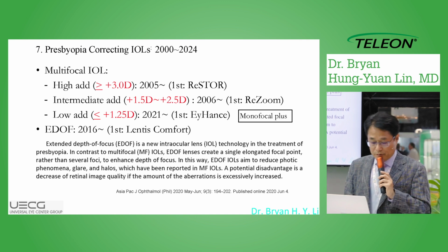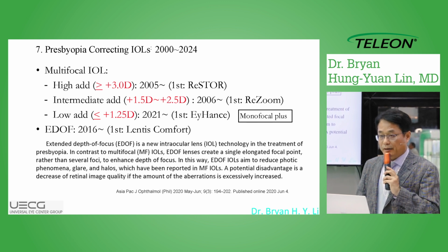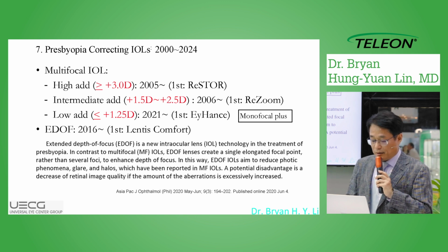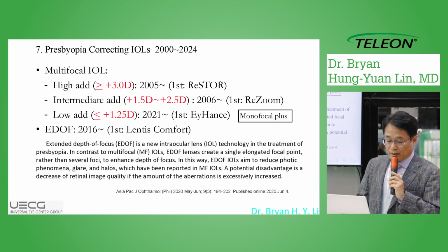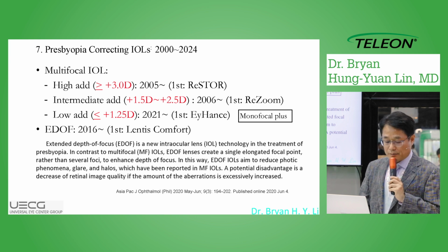A new type of EDOF IOL is designed to create a single elongated focus point rather than multifoci to enhance depth of focus. This approach aims to reduce photic phenomena such as glare and halos, which are commonly reported with multifocal IOLs.